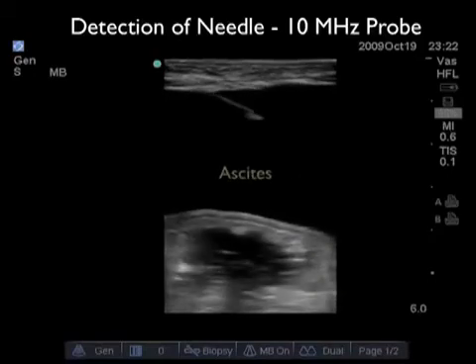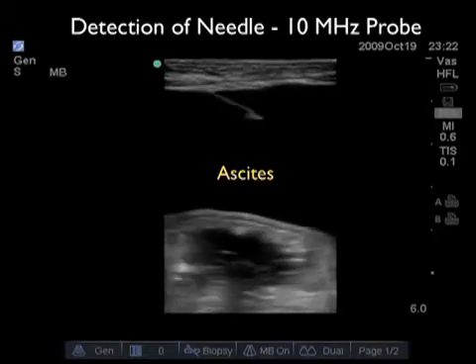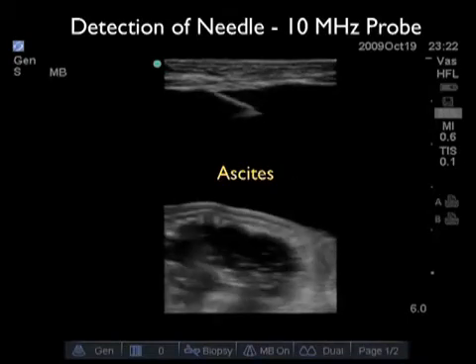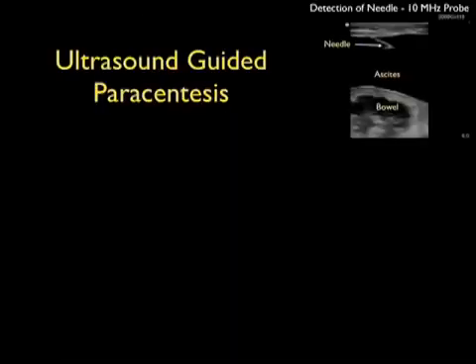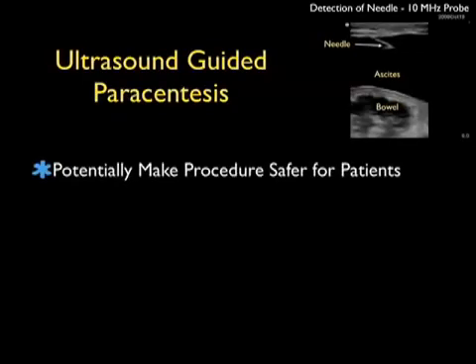In this video clip we can see how using the higher frequency 10 MHz probe allows real-time guidance of the needle down into the ascites pocket. We see detection of the needle coming in from left to right through the abdominal wall with the tip of the needle safely parked within the ascites fluid. Notice that the bowel is distant to the tip of the needle, thereby minimizing any risk of bowel puncture during the paracentesis procedure. A sterile sheath must be placed over the probe during this procedure.